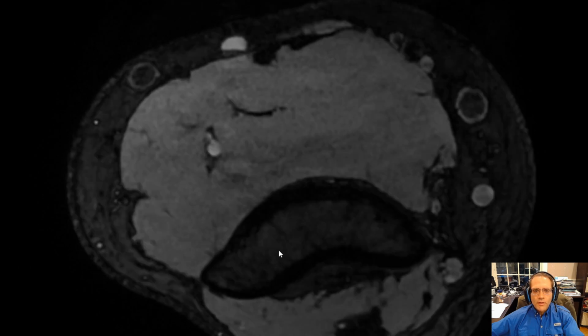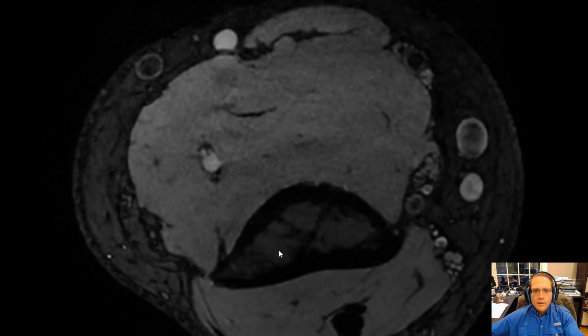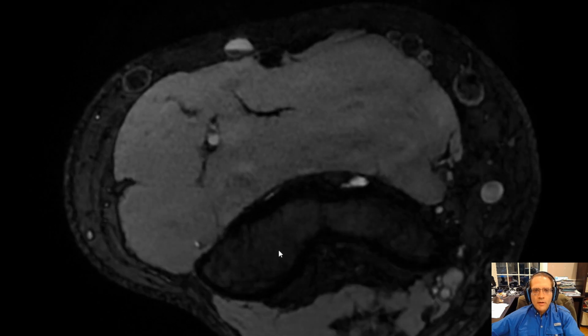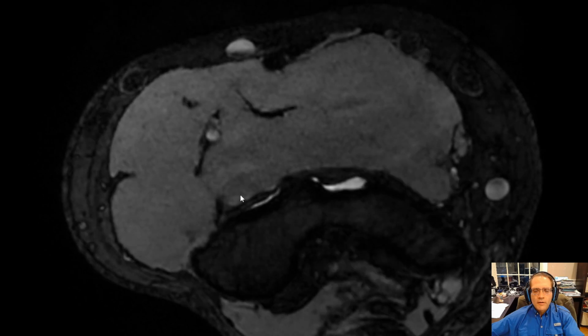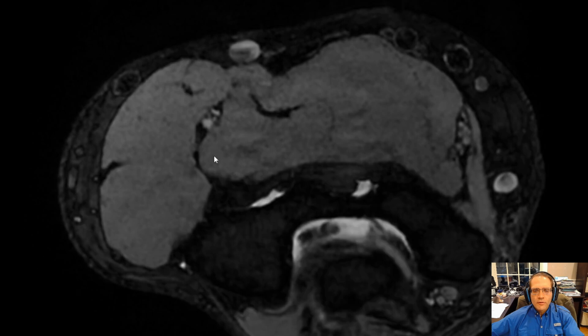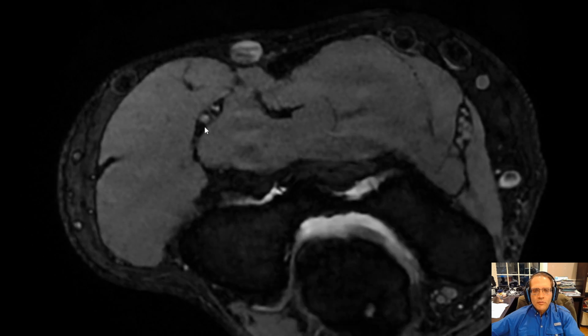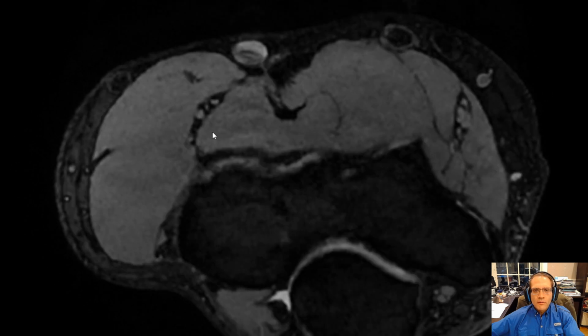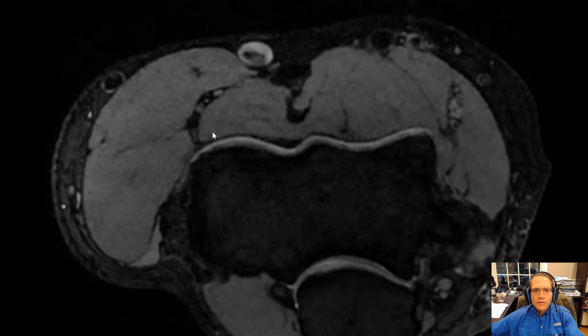So if I roll through that again, normal, constrict down, and then it comes back up to the end here. So that's the first point of constriction. And as we follow it down further, as we get to where the nerve starts to branch into the deep branch and the superficial branch, as we come down, there's a second point of constriction right there.